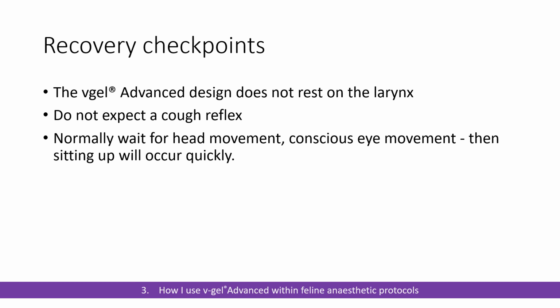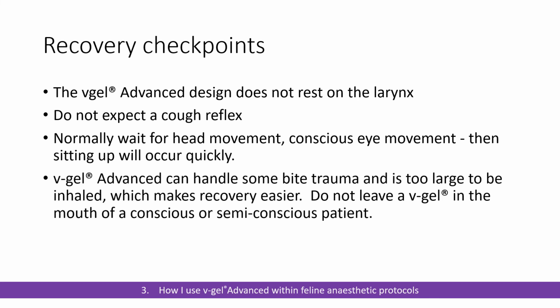Normally I wait for conscious eye movement or conscious head movement, something like an ear flick if you tickle the ear, or little facial twitches, or the cat just rolling their eyes and looking at you. And sitting up will occur fairly quickly after that, normally within about 10 or 15 seconds or so. The V-gel advanced devices are quite tough. They can handle some bite trauma, and of course they're too large to be inhaled, and that does reduce the stress in that immediate recovery period.